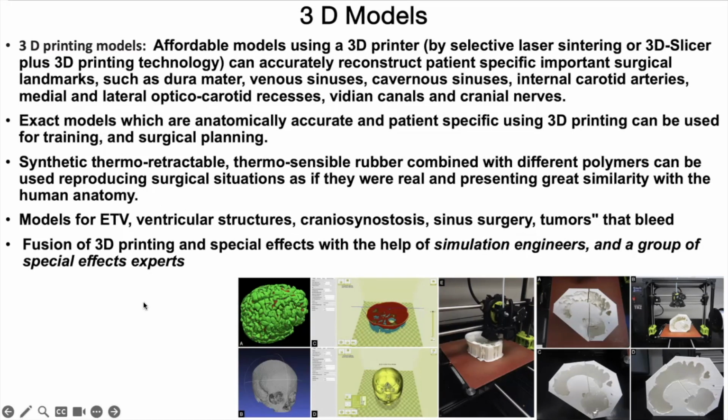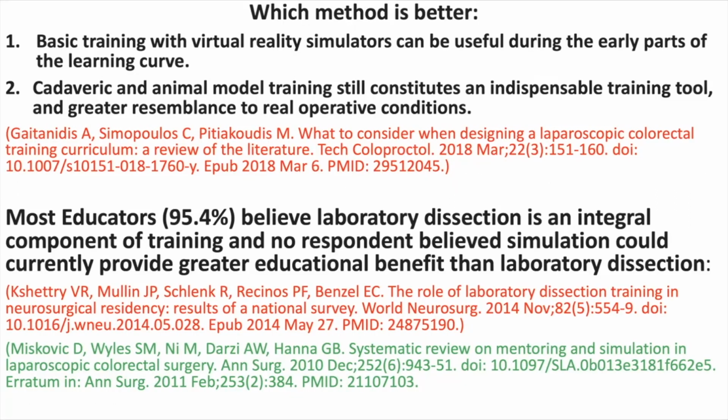Fusion of 3D printing and special effects, with the help of a simulation engineer and a group of special effects experts, can be made. As shown here, 3D printing models can be prepared. So which method of training is better?